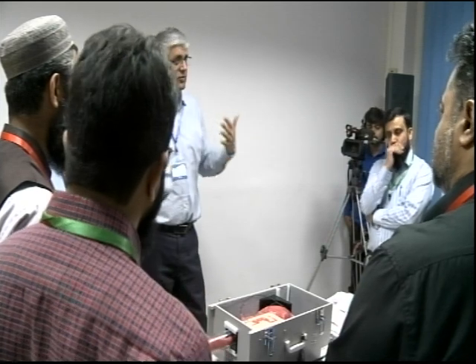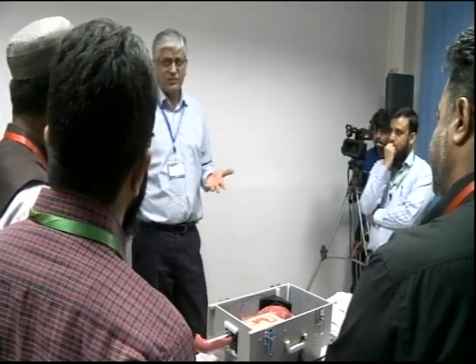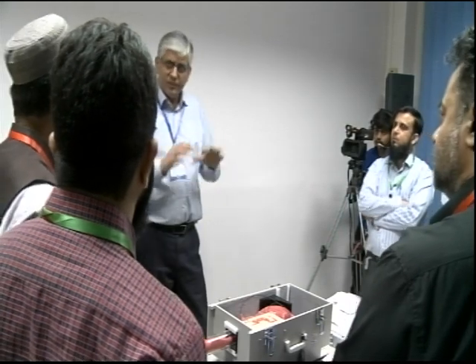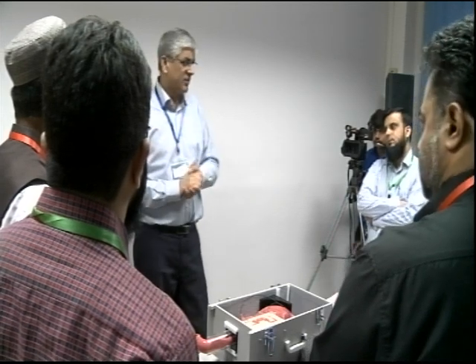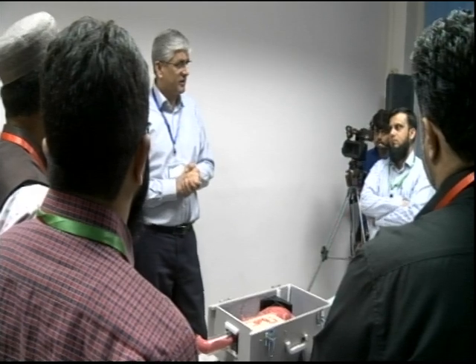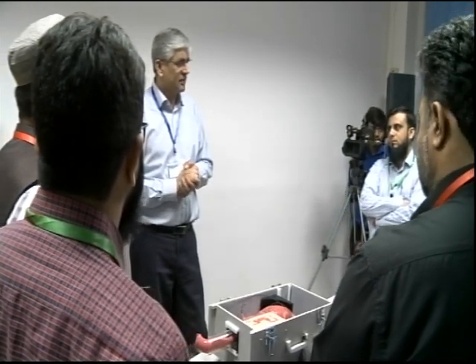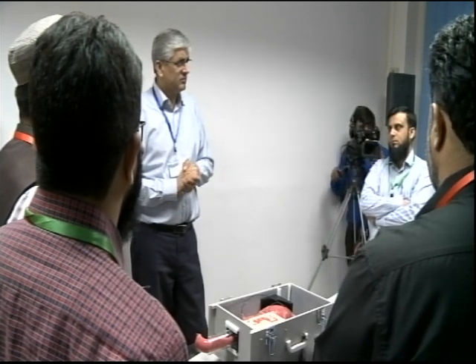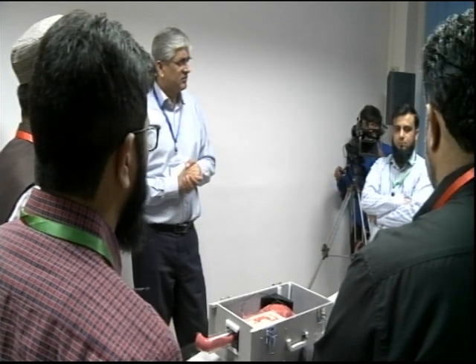Now, what positions do you normally have your patient in when you're doing ERCP, doctor? Completely prone? Okay. And all of you? Sometimes. Usually we have flat. Sometimes when we have to support the abdomen, very few, 2 out of 100, 1 out of 100. Okay. What's the advantage of that? So when we have a flabby abdomen.